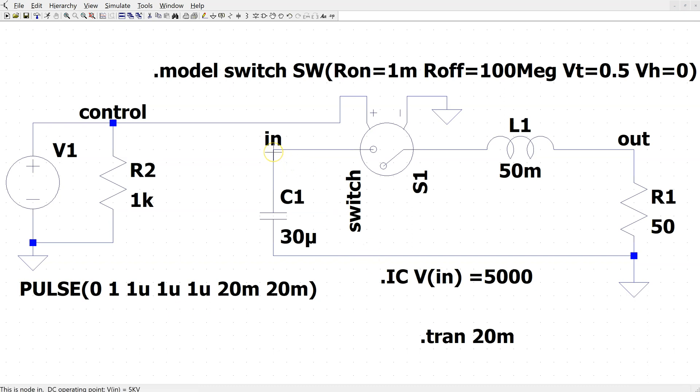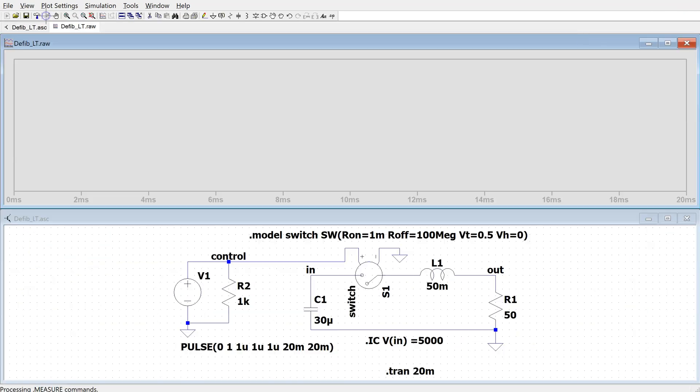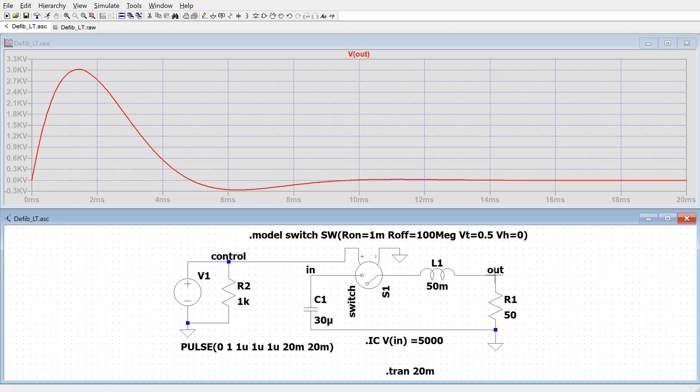We label this node and then use the IC spice directive to define the initial voltage across the capacitor. We are running a transient simulation. We can run this simulation and look at the output voltage.